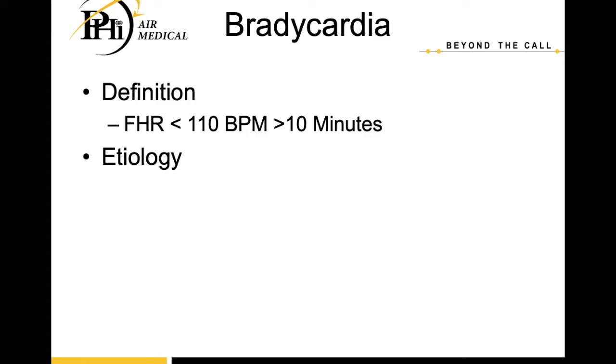And we could see bradycardia from a prolonged cord clamping or cord compression, like in a prolapse situation where we had a lot of decelerations that turned into maybe a prolonged deceleration that now has turned into a change in the baseline to a fetal bradycardia. So something to be very mindful of.